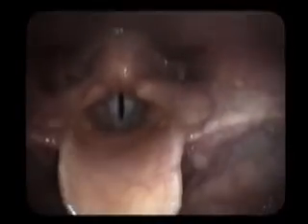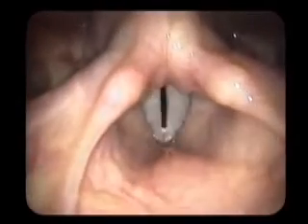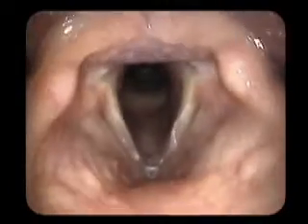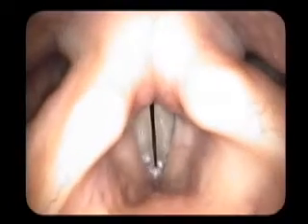The stroboscopy light will now be turned on. E-e-e. E-e-e. E-e-e.